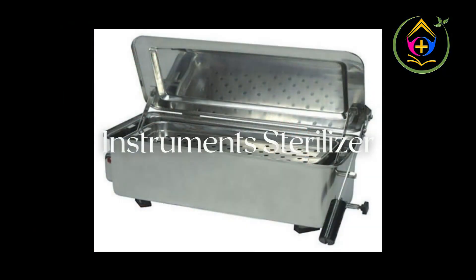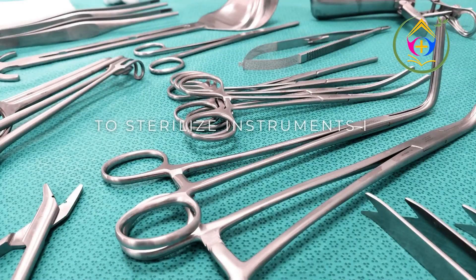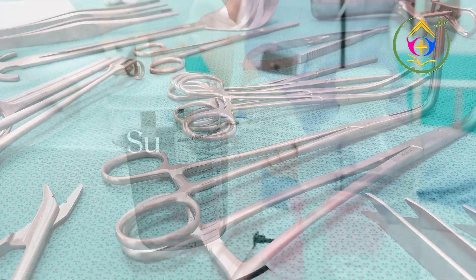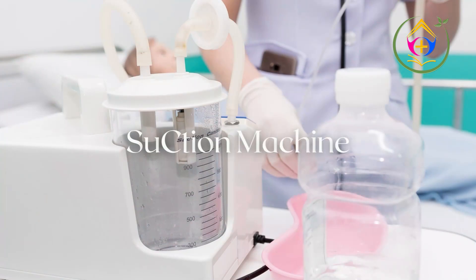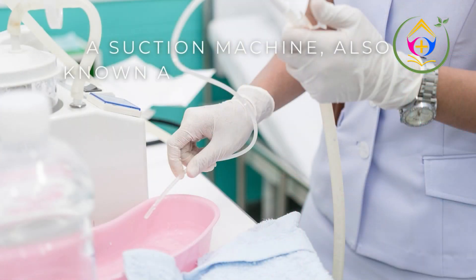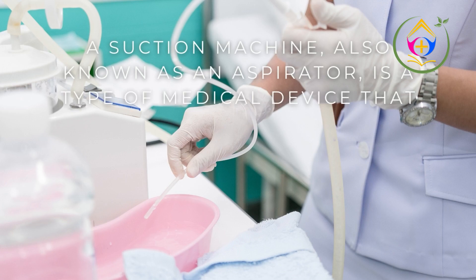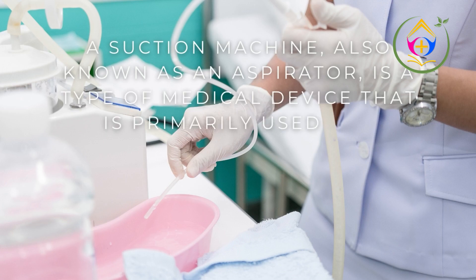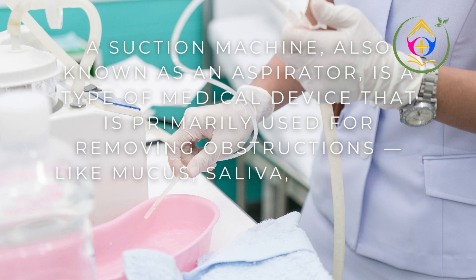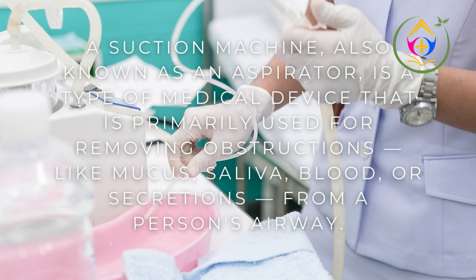Instrument Sterilizer: used to sterilize instruments in the absence of an autoclave. Suction Machine: also known as an aspirator, is a type of medical device primarily used for removing obstructions like mucus, saliva, blood, or secretions from a person's airway.